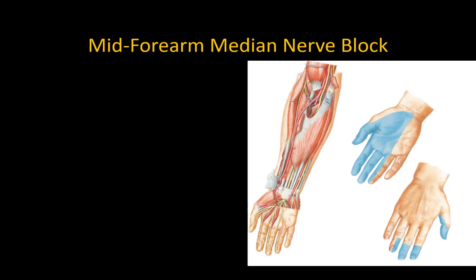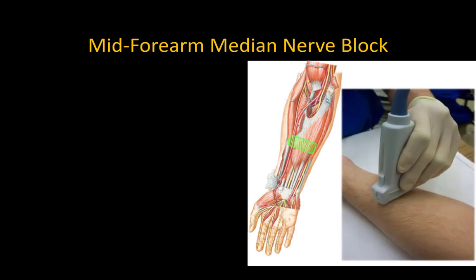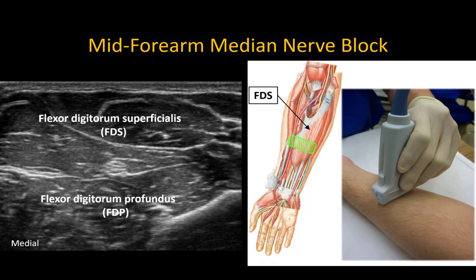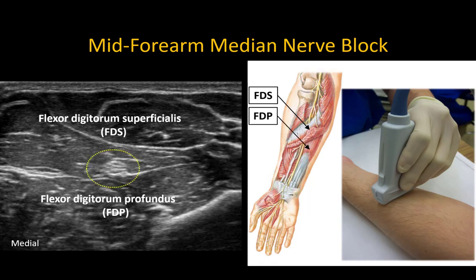Start with a mid-forearm median nerve block by placing the patient's arm in a supinated position and placing the probe in a transverse orientation on the fleshy ventral portion of the mid-forearm. At this location the median nerve is always sandwiched between the flexor digitorum superficialis and flexor digitorum profundus muscles. The nerve can be anisotropic, so tilt the probe back and forth as needed to make it light up against the muscles.